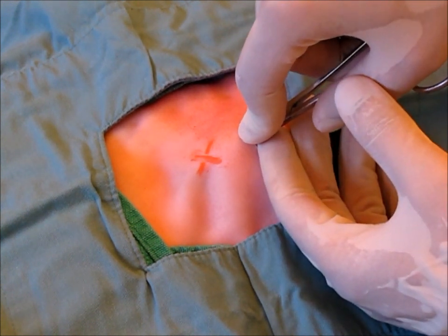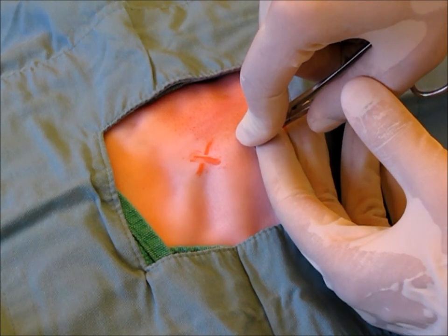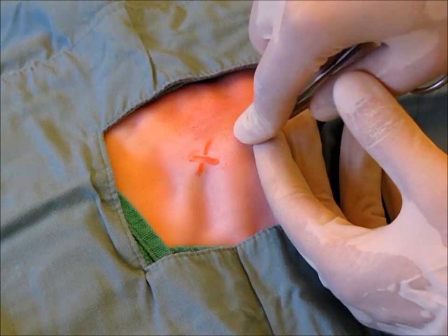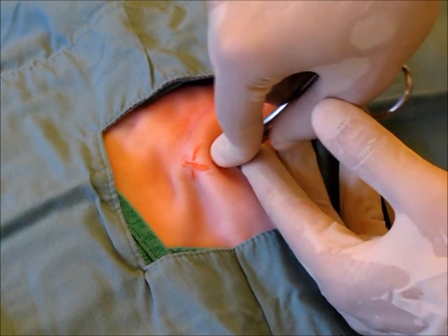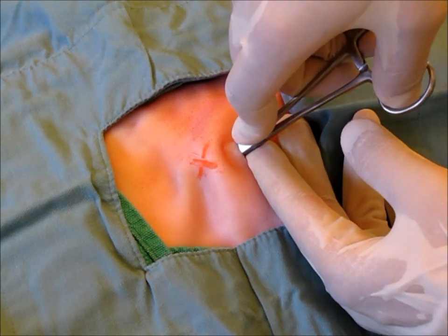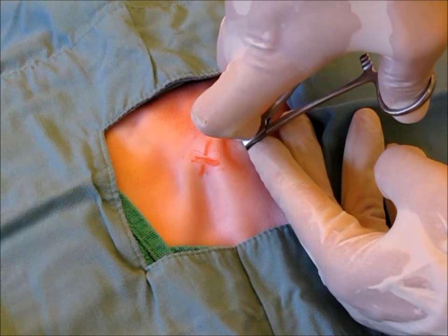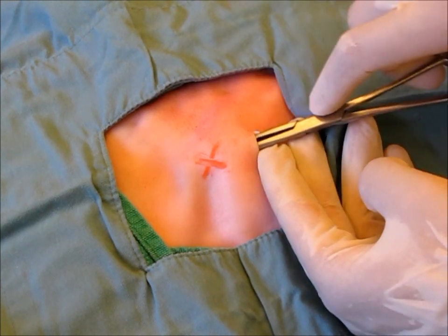Once you reach the pleura, gradually advance with controlled pressure until you feel a distinctive pop — that will be the kelly puncturing the parietal pleura. Next, gently spread open your kelly, expanding the hole within the parietal pleura, and slowly retract the kelly clamp.